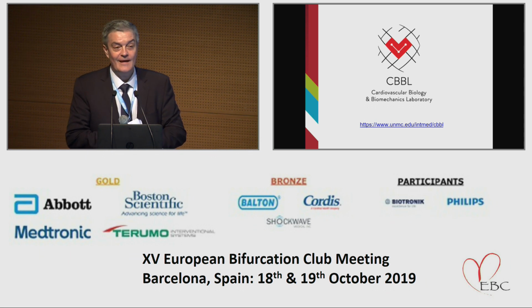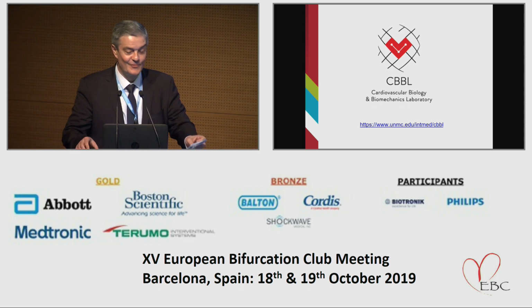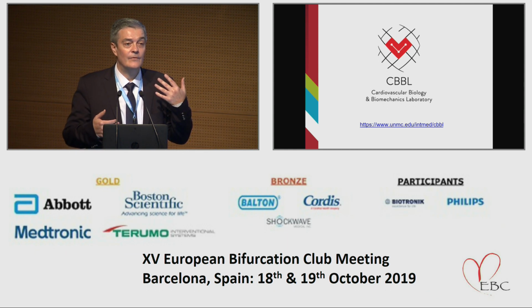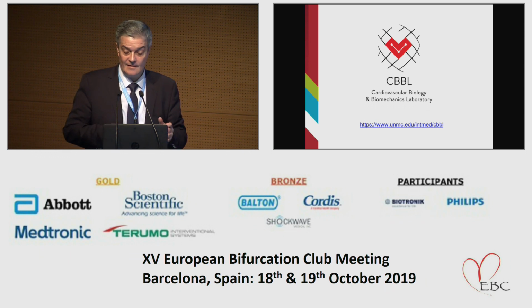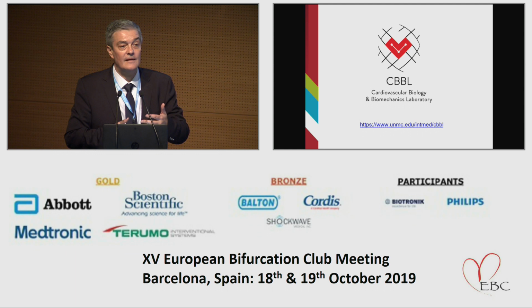So for a long time we have been discussing main vessel first or side branch first, and what we would like to have and what we don't like to have. And I think now we have very nice material from Visible Heart and from OCT to base our decisions on what we exactly see and measure. What we try to prevent, at the level that is possible and feasible, is overlap of metal that is potentially unnecessary. The idea of the EBC is to promote proximal optimization with POT, then distal recrossing.